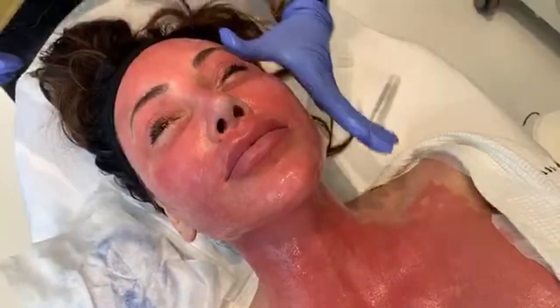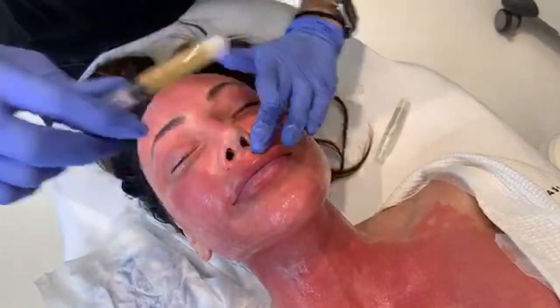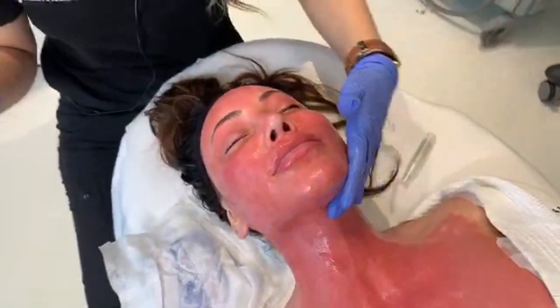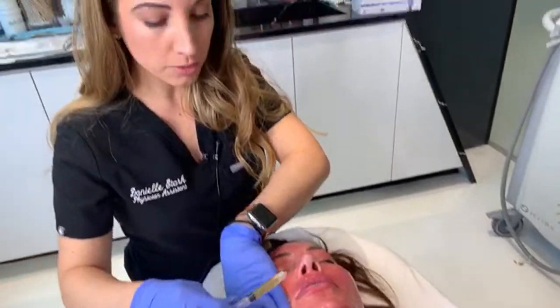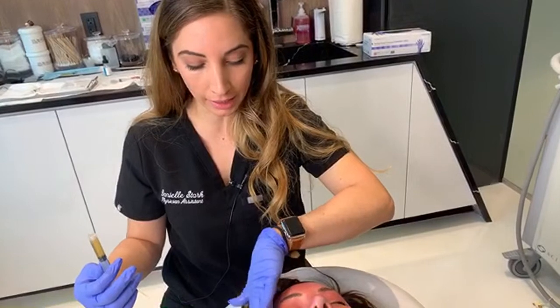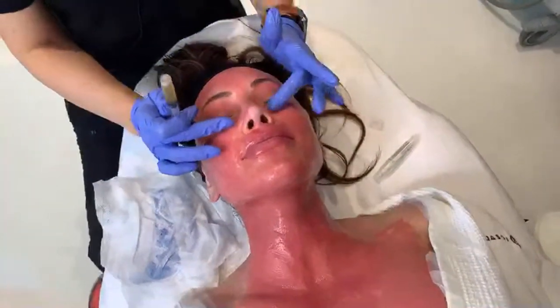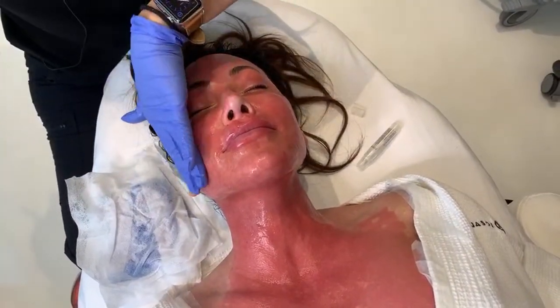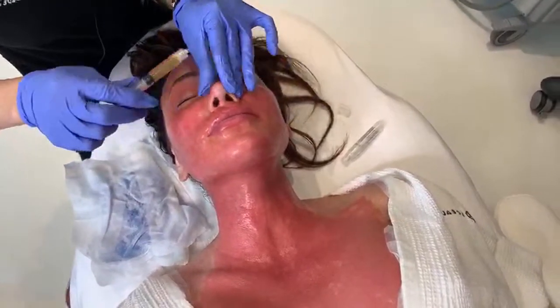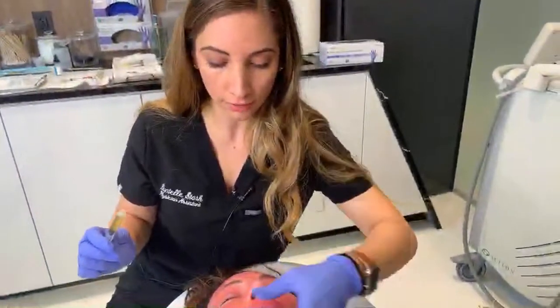So erbium is that really great middle ground. We consider it not as aggressive as a CO2, with significantly less downtime because you're not getting that scabbing part of your healing process. You'll just be red, hot, and then each day it'll get a little bit lighter and you'll have a little bit of light shedding. Not dramatic peeling. She will probably get a little bit of darkening of the skin around the eyes, but that's because the skin is much more sensitive in that area. And her downtime will be pretty manageable. And of course, she's going to follow her skincare protocol and the healing, using the mask, hydration, all of that to really get it through.